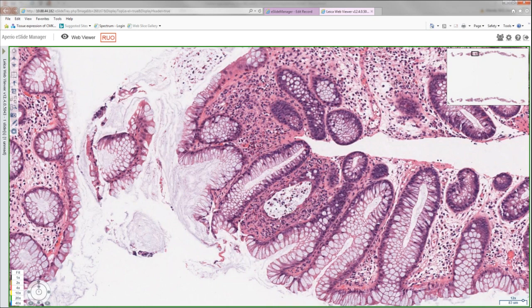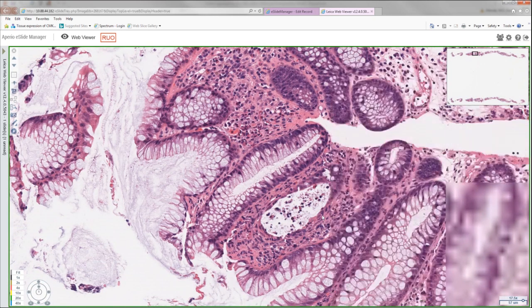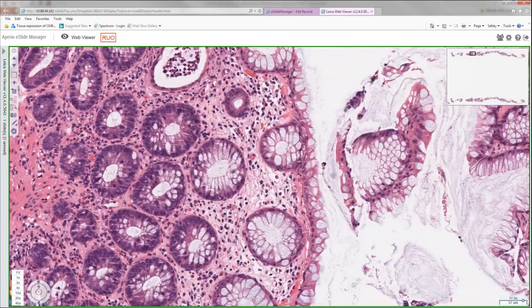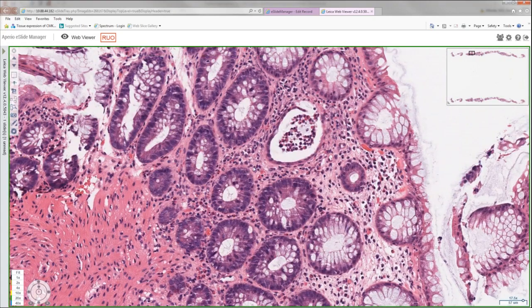There's inflammatory cells in the lumen with, well, when I get a little closer so you can see it, some eosinophils, some neutrophils, and also cellular debris. Here there's another example. So it was patchy, but definitely evidence of micro abscesses.